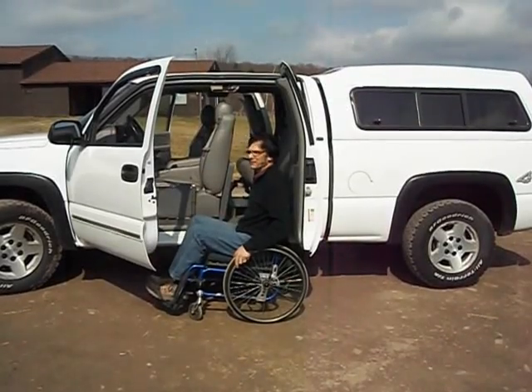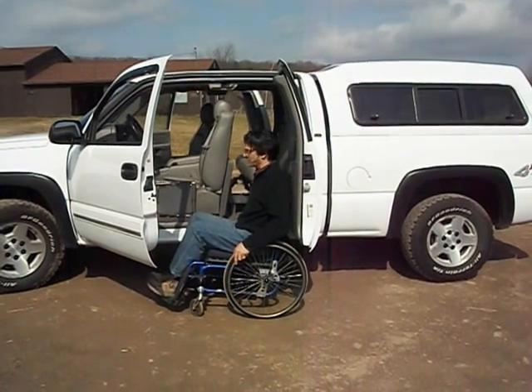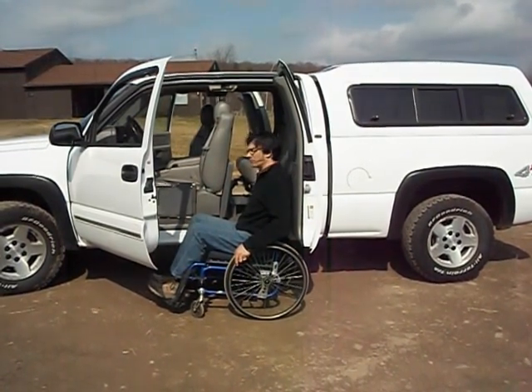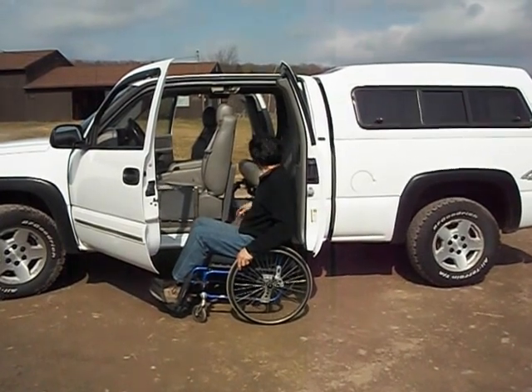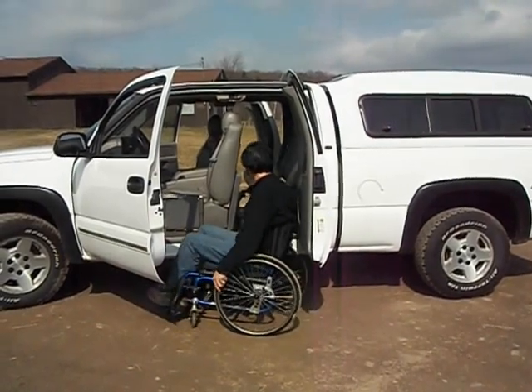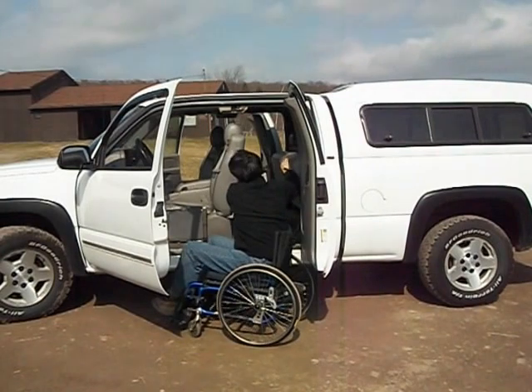This is the Access Unlimited EZ-STOW MI and Glide and Go combination to get you mobile in a pickup truck. The EZ-STOW is compatible with the factory seat in the rear. You simply put it down when the lift is not in use, so you can have passengers in the rear, and then when you're ready to use it, lift and stow.